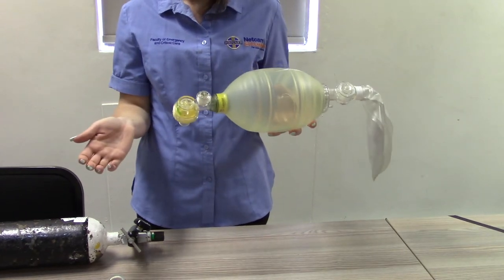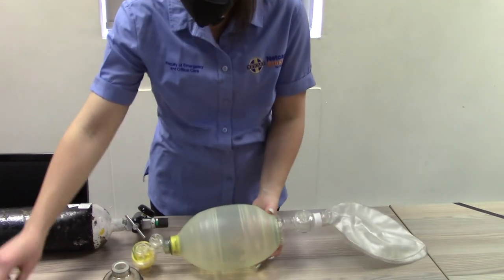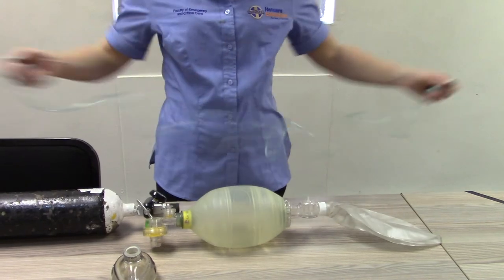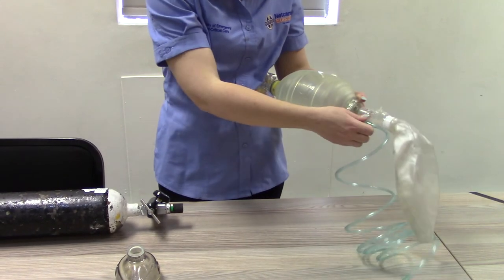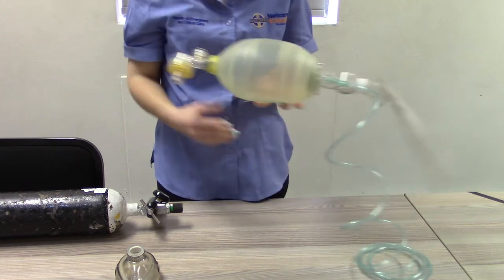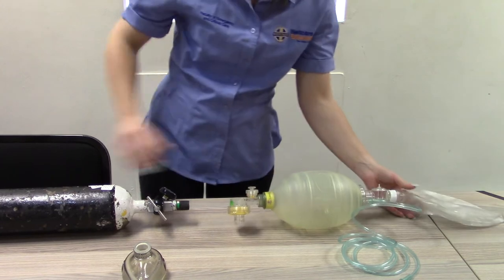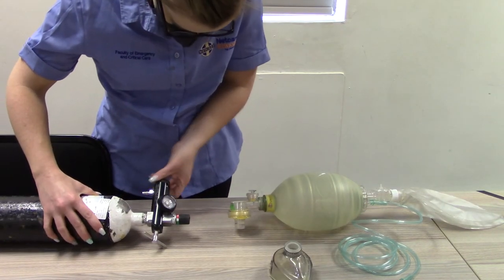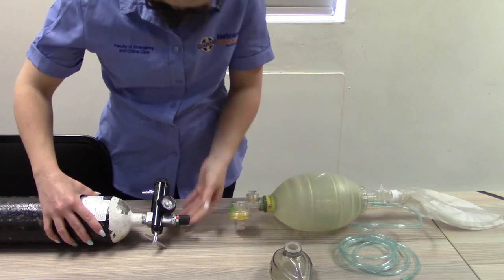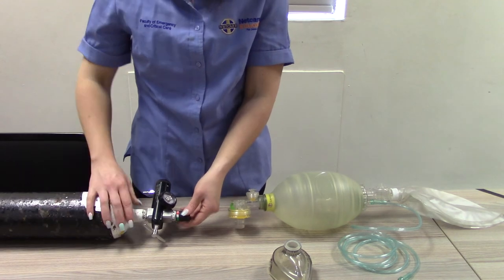Connection of oxygen to BVM. Attach the oxygen tubing to the oxygen inlet nipple. Set the oxygen flow rate to 15 liters per minute. Ensure that the reservoir inflates and no air leaks are present.